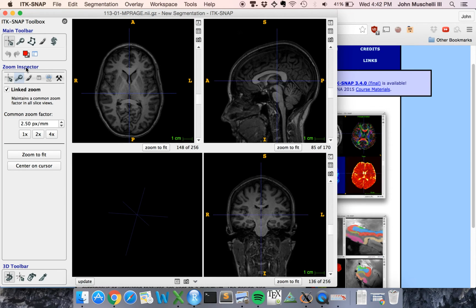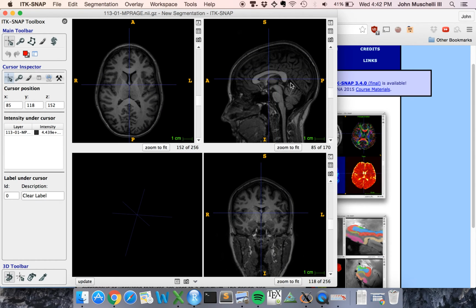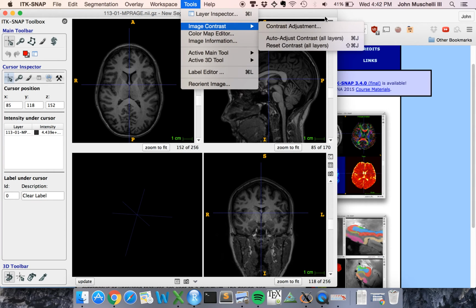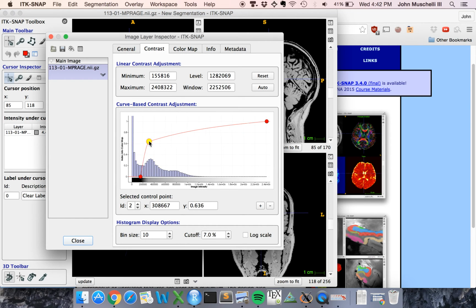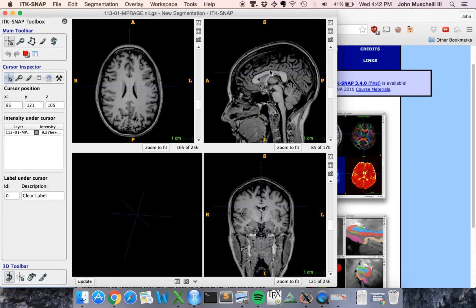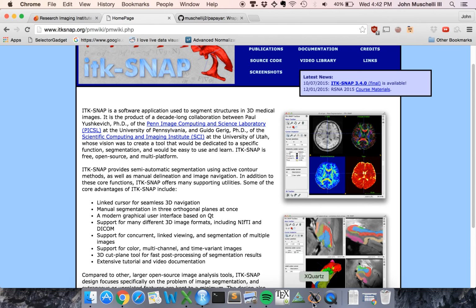Now, that being said, for reproducibility, we do suggest that if you're going to do publication figures or anything like that, then I would do that in R using ortho2 or the image function to actually plot the data so that I can reproduce it later, right? So we can, again, adjust the contrast. This is kind of similar to the transfer function that Elizabeth should have touched on previously. So anyway, these are good pieces of software that are not specific to R. They have nothing to do with R that allow you to interactively view your images.